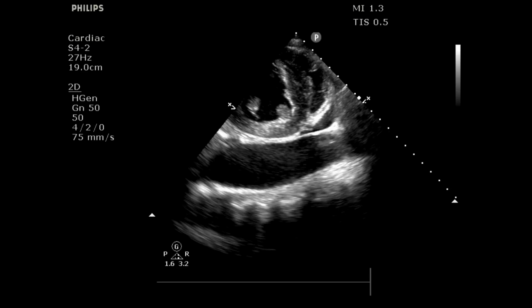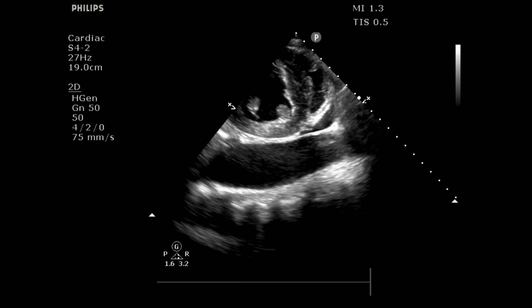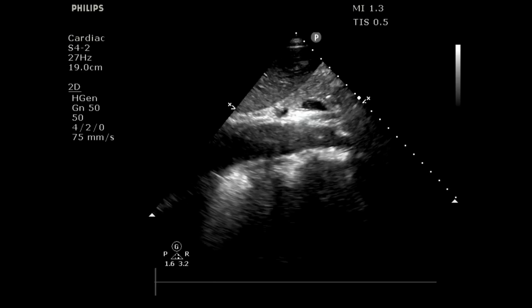If you look off to the right-hand side in the long axis of the aorta, there is a small little echogenic line inside that aorta, and that caught our attention. From this window, I can't say for sure that it is or is not a dissection flap, but it certainly alarmed us. You can have some artifact that causes things similar to this, but it certainly got us concerned that there could be a dissection in this patient. And as you look here, there's a little bit more obvious pericardial effusion in this patient, though certainly not large and not likely the cause of the patient's sudden imminent demise.